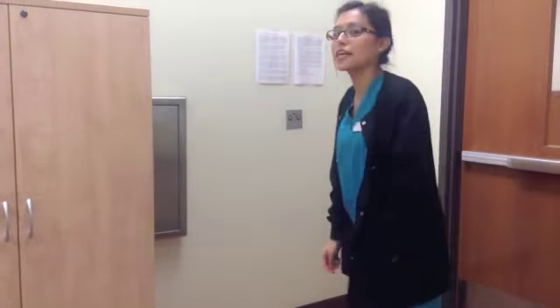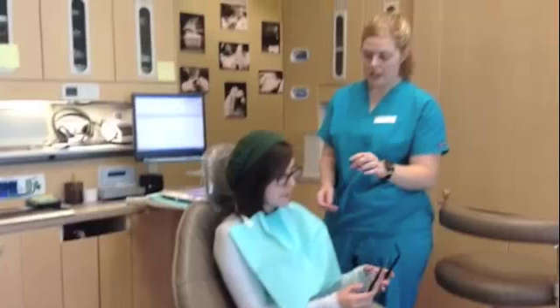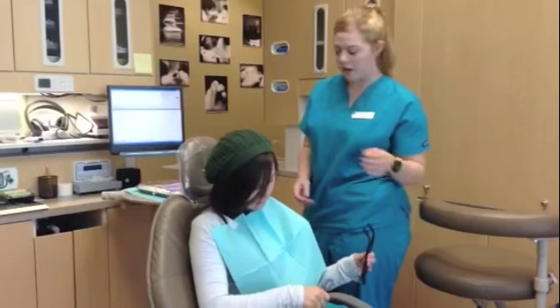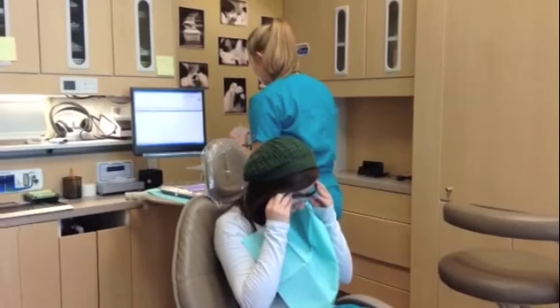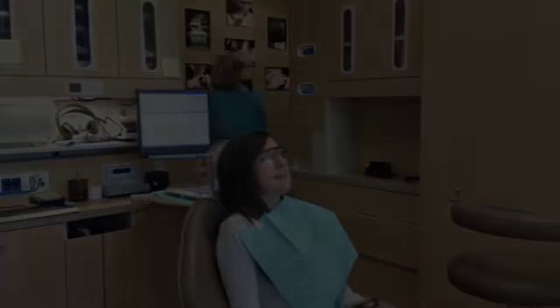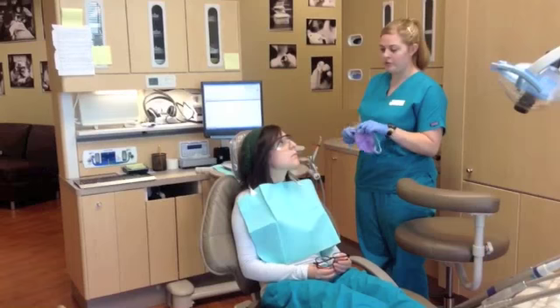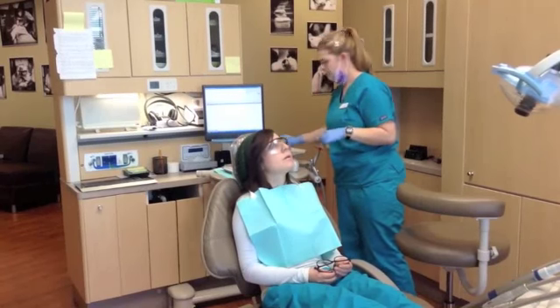Okay. Now I'm going to give you these safety glasses, okay? Okay. Here you go. Do I need to take off my glasses? Yes. I'll put them over here on the side. I can hold them. Okay. And let me go see if the dentist is ready, okay? Okay. Okay, just to let you know, we're going to do amalgam on number 19, and that's your first molar on the bottom. Okay. Okay?